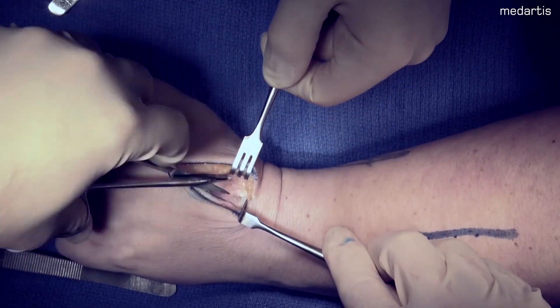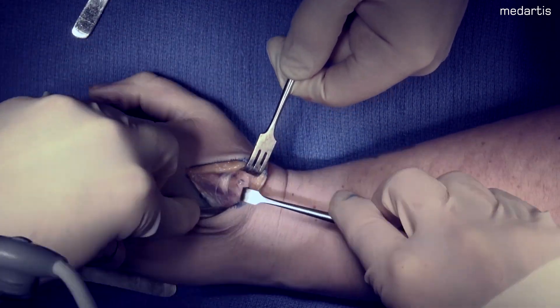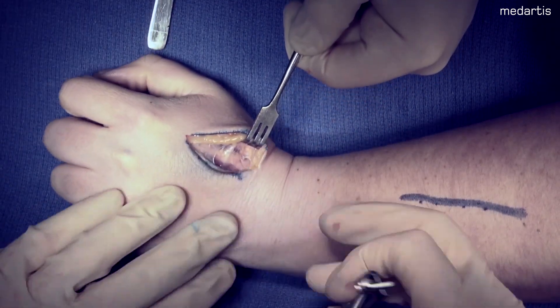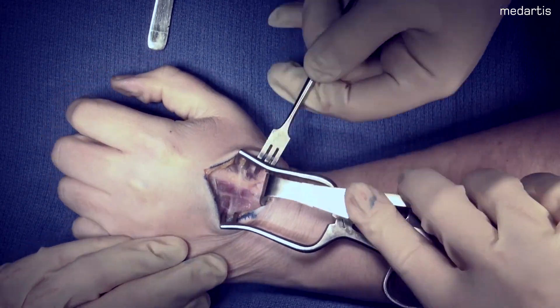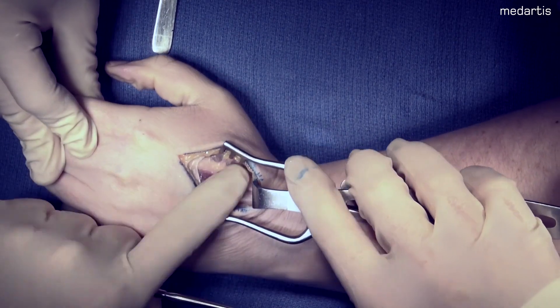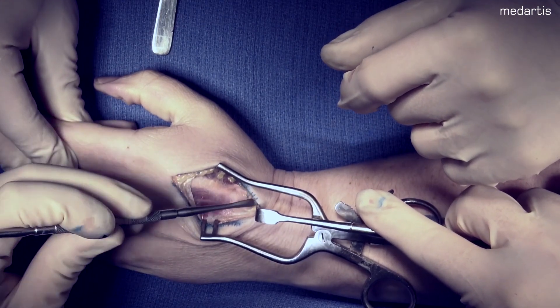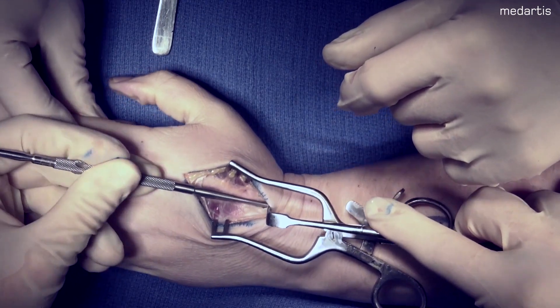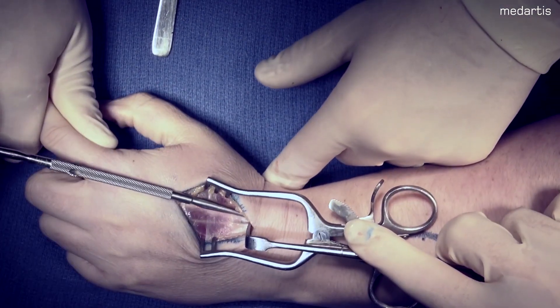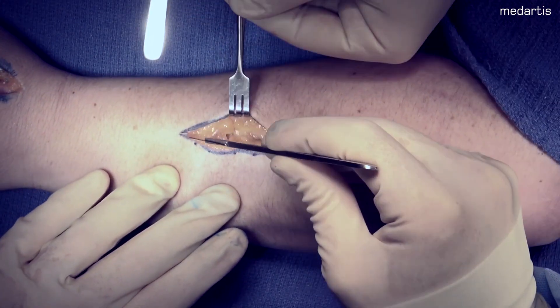One of the tricks distally is to make sure you can see the ECRL and ECRB coming into their insertions. This is your window for the plate to slide under the second dorsal compartment. Here is the ECRL tendon inserting into the second metacarpal; therefore your window is underneath it. I use a freer to dilate proximally. Now that we have our distal window, we're going to go ahead and go proximal to make our incision and dilate from proximal to distal.